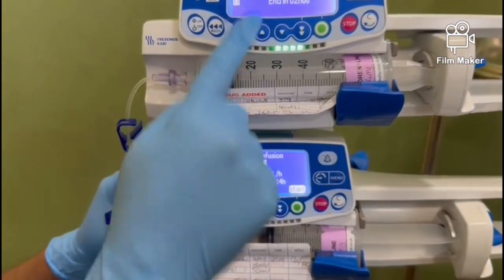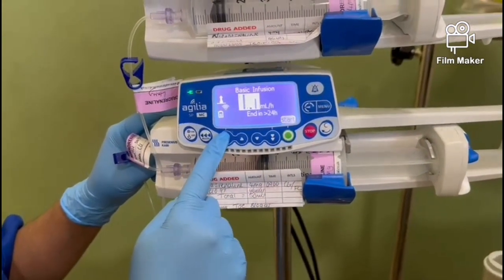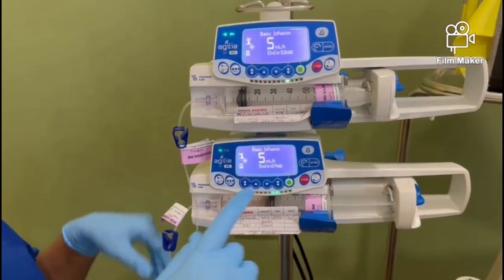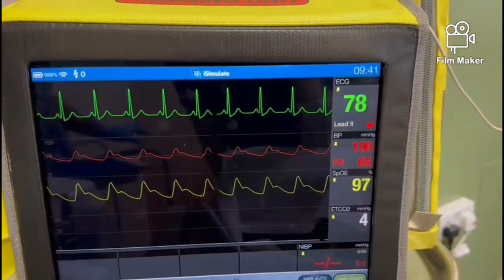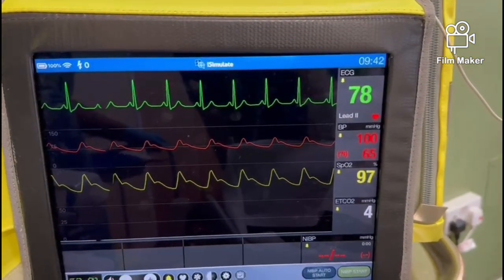As we are double pumping the same strength of 4 mg, we will be going for the same rate, which is 5 ml an hour. As we have connected our new 4 mg noradrenaline infusion to an octopus lumen already primed with the same strength, it should not take long before we see a response in the patient's blood pressure.